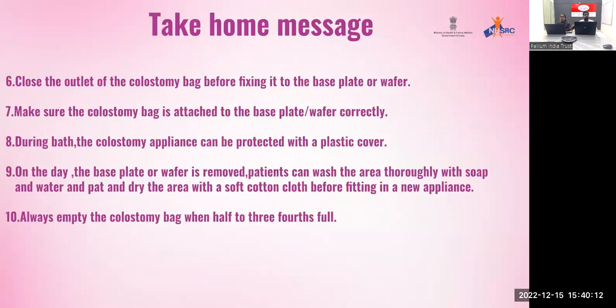Close the outlet of the colostomy bag before fixing it to the base plate or wafer. Make sure the colostomy bag is attached to the base plate or wafer correctly. During bath, the colostomy appliance can be protected with a plastic cover. On the day the base plate or wafer is removed, patients can wash the area thoroughly with soap and water and pat dry the area with a soft cotton cloth before fitting in a new appliance. Always empty the colostomy bag when half to 3/4 full.